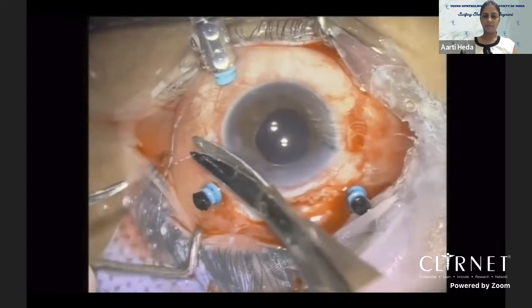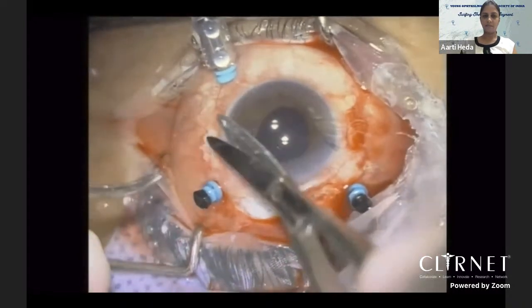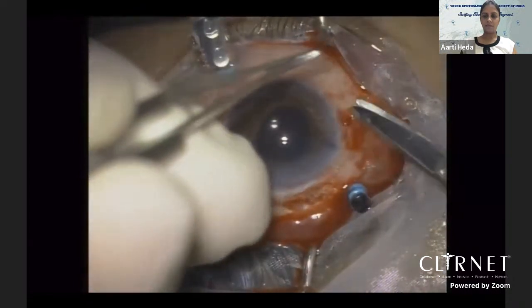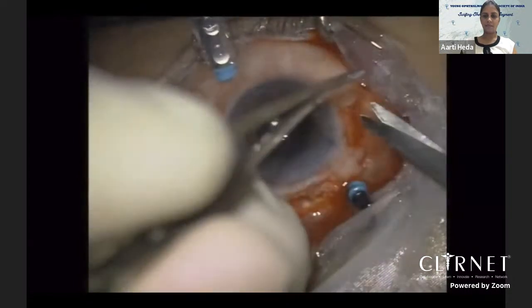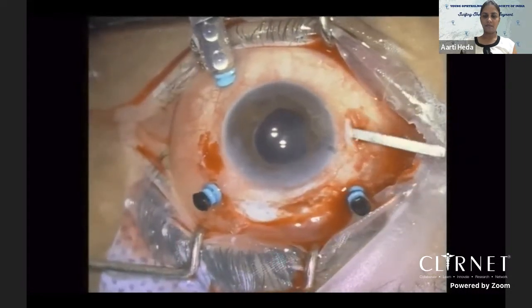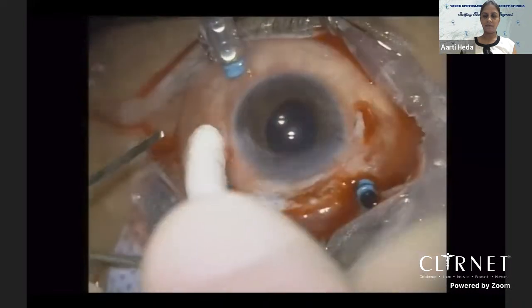Now we have to ensure that the sutures are cut at appropriate lengths so that they can be completely buried inside the scleral pocket. Because if a small part of this is protruding, that can lead to a lot of grittiness to the patient.